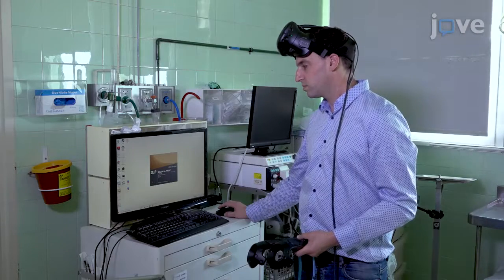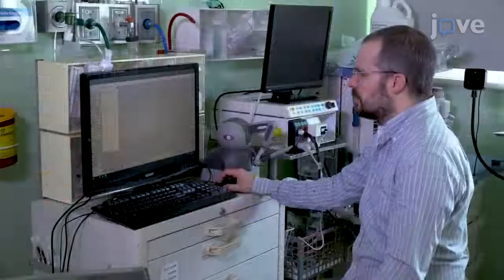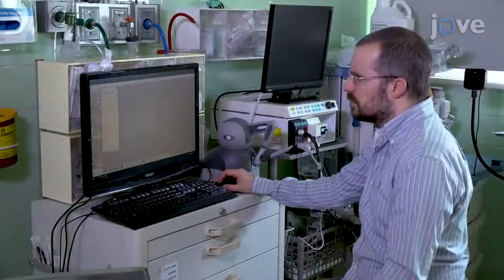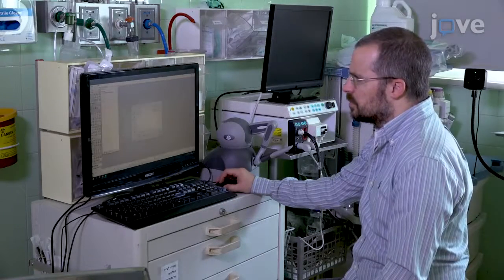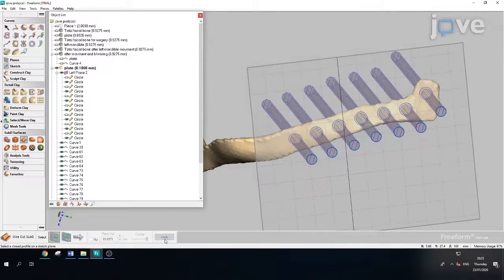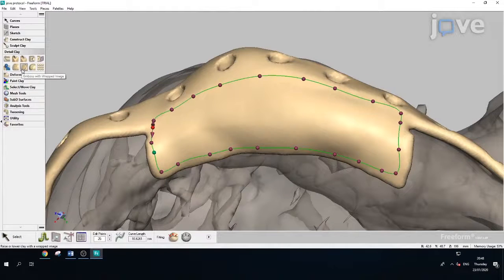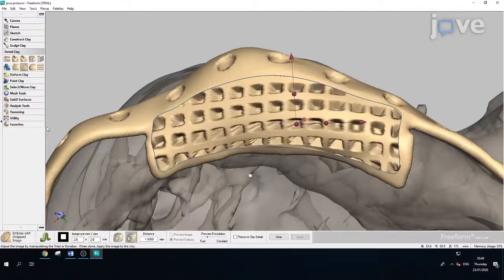Although these programs are very user-friendly, it does take time to master the computer-assisted design process. Patience and practice will help the user get better and quicker. As this protocol contains many steps of virtual planning, observing the stages will be extremely helpful.